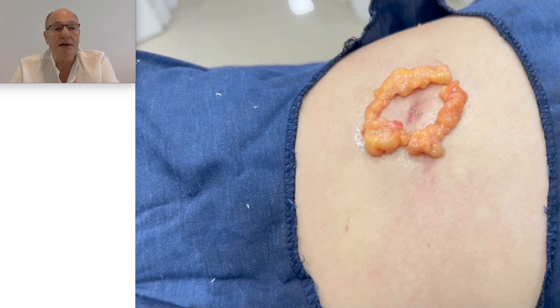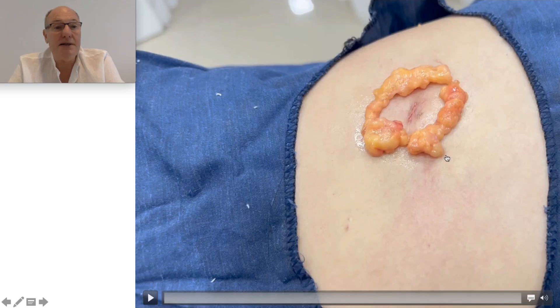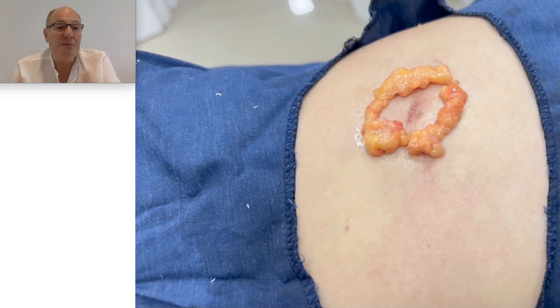The patient will not want to have recurrence. This tumor was removed entirely. If you use liposuction, you have left cells that are reproducing again, and maybe bigger. But with my technique, I remove the full lesion, and it's finished.